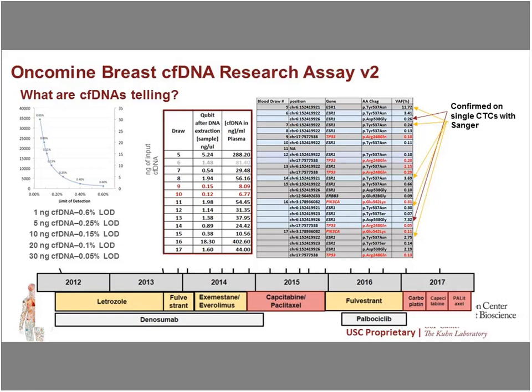We are currently testing this hypothesis, and we don't have a solid conclusion yet, but we would like very much to know what is happening on the single cell level and how we correlate that with the Oncomine result, and to explain the uprising of clone 4.